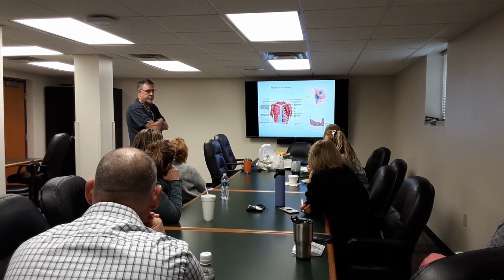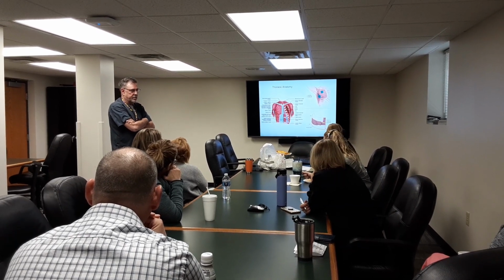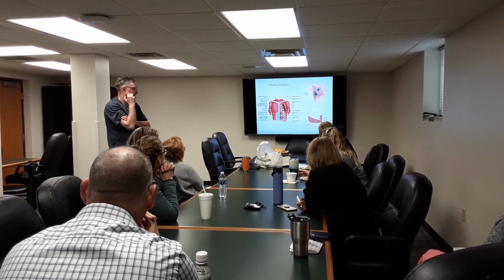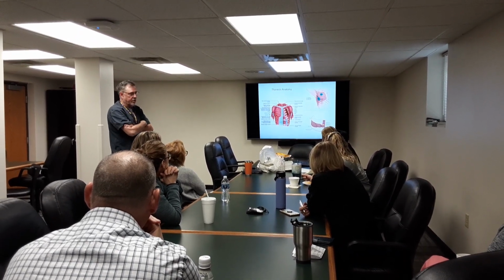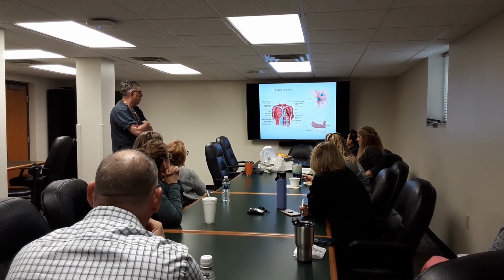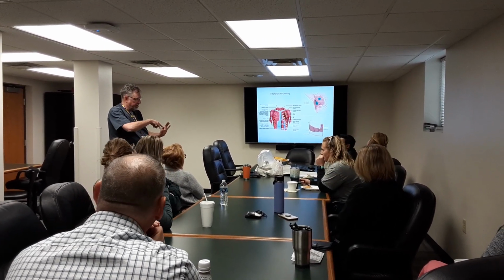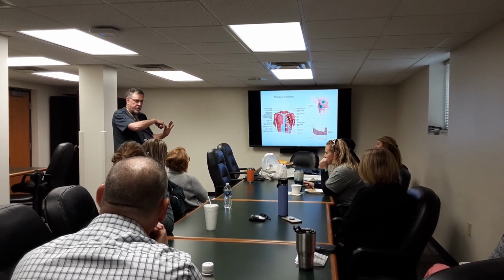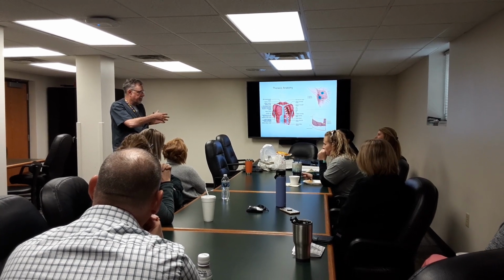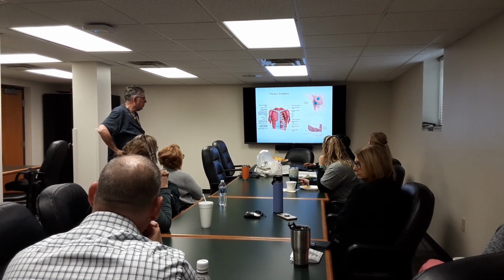What are you worried about going to other places? You get into nerves and veins and arteries. So that's the zone of safety, just below the hairline, and you're aiming for about the fourth or fifth interspace. The person is supine on the table, and going in the mid-axillary line, directing a little bit down, is not a big deal. It's a three-dimensional structure: when the lung collapses, it collapses not just side to side but front to back. We'll go over that in a minute.